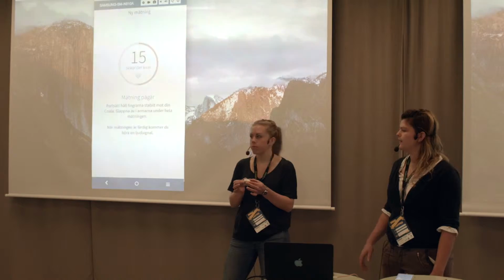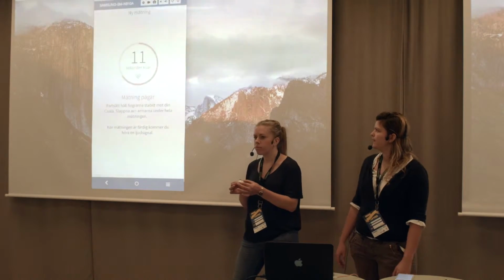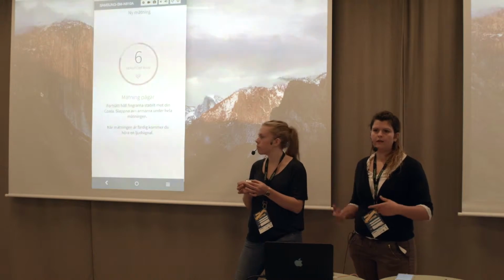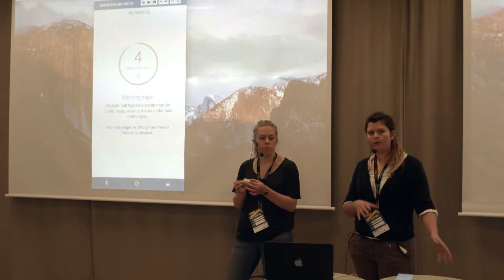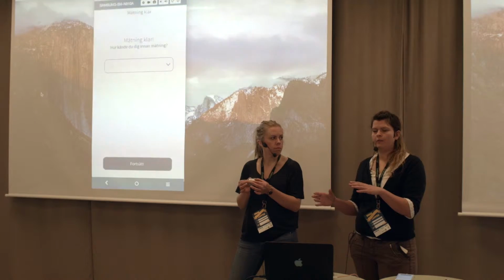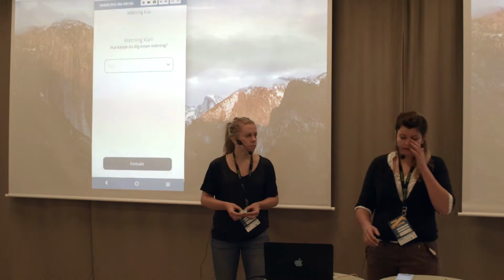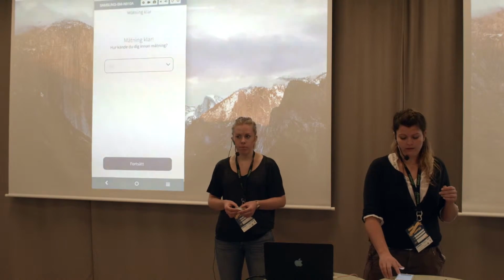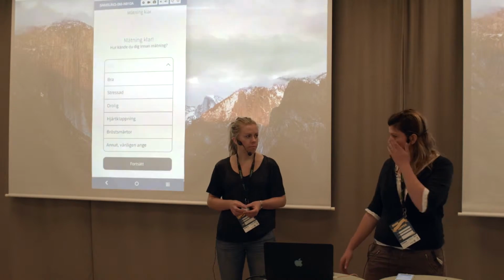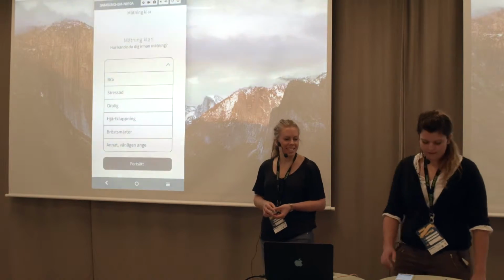Right now we don't record any sound, it's just the electrocardiogram from the finger, and we do the same thing with this set of data. We run it through an algorithm to see if it is good enough. Then we send all the data to the server, and it will be run through a bigger algorithm, calculating and indicating what kind of result it is. So Linda, how do you feel? I feel quite stressed actually. Stressed, yes, okay.